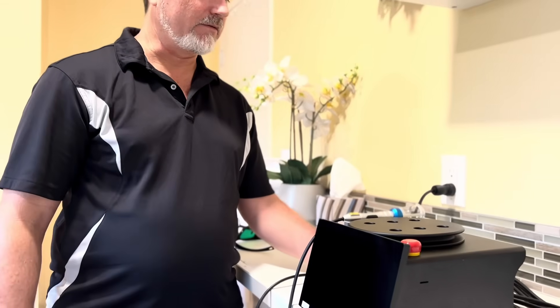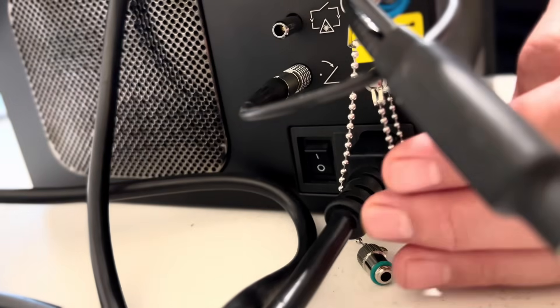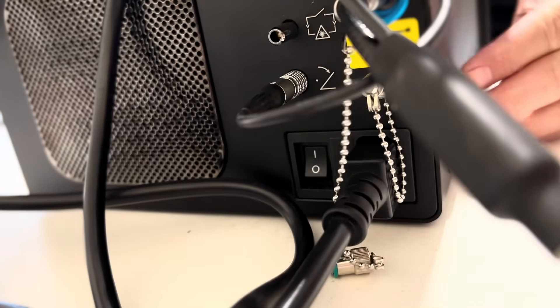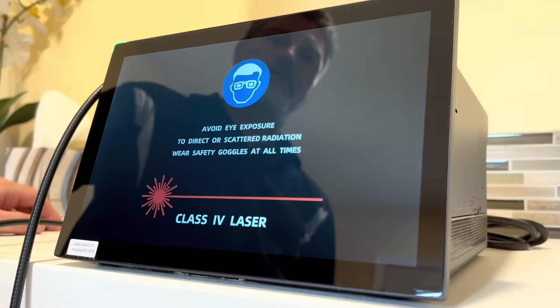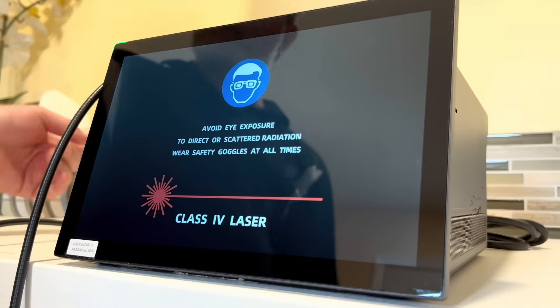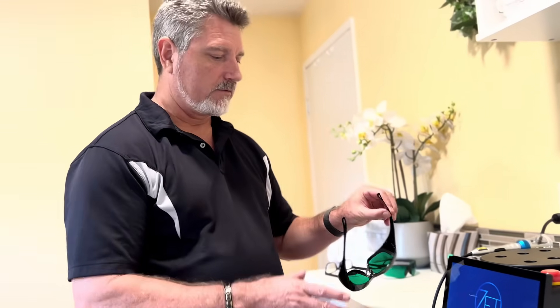All right, we're back. We've got the Laser Remy FX 45 watt, boxed and plugged in right here, ready to go. We'll go ahead and click the toggle switch in the back. It's about a minute for it to fully get up and running. Meanwhile, we need to put on our protective eyewear.